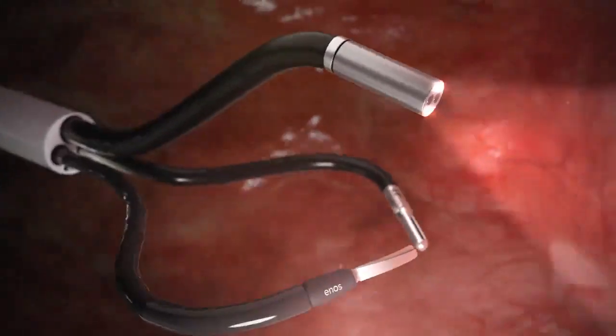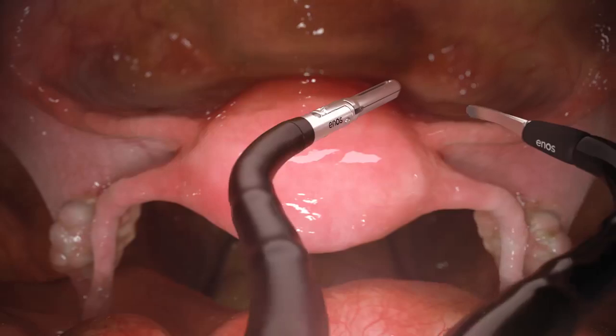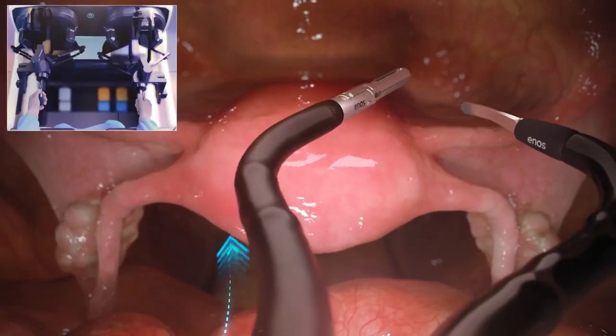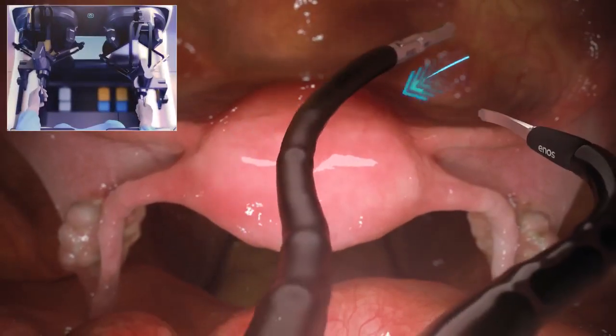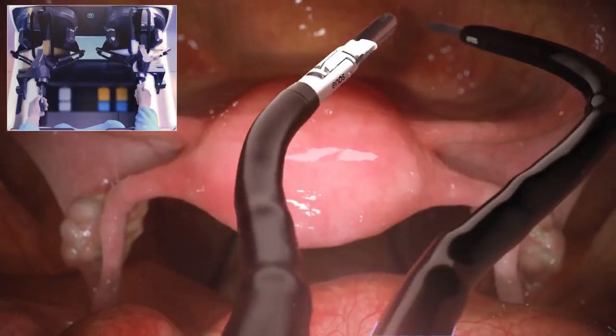The Enos system is designed to translate the surgeon's natural hand movements into fluid and dexterous instrument maneuvers.